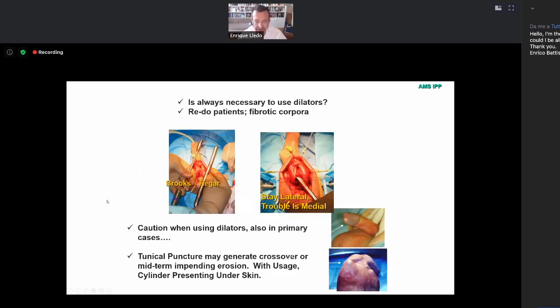Yes? Sorry, we've got a question from the audience. If you've got a patient who has come in shaved, and you discharge the patient without surgery, how long would you wait before you would actually bring that patient back to have the surgery, if they'd pre-shaved themselves at home?